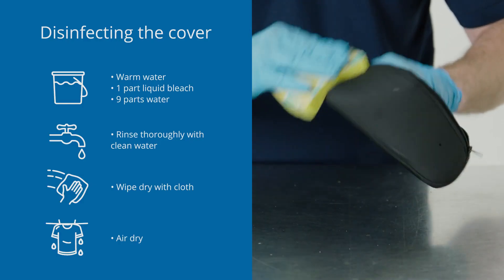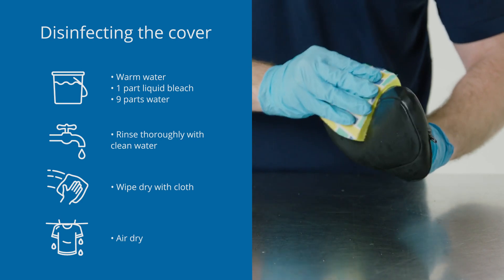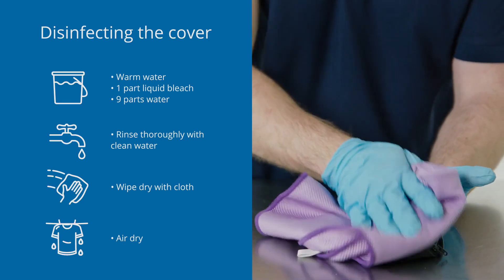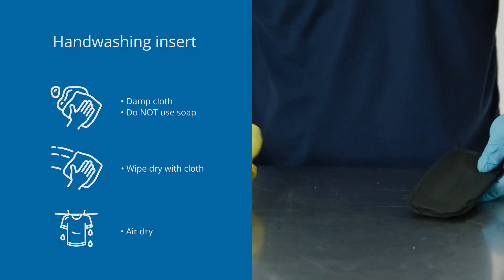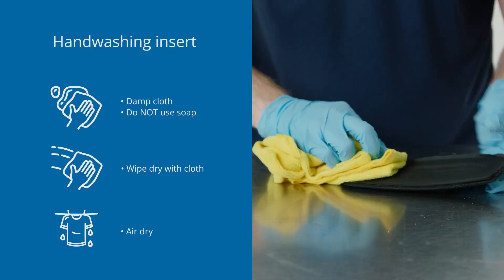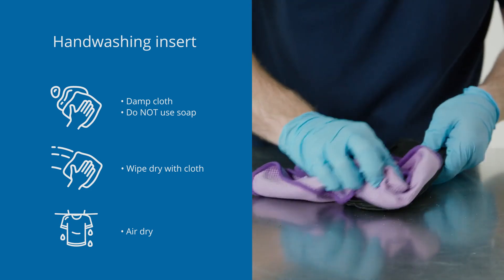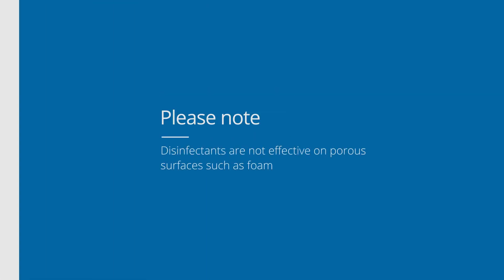To disinfect the cover after cleaning, hand wash in warm water using one part household bleach per nine parts warm water. Rinse thoroughly with clean water and allow to air dry completely before use. For cleaning the inserts, wipe lightly with a damp cloth, making sure not to use soap. Wipe the inserts off with a clean cloth and allow to air dry flat completely. Please note that disinfectants are not effective on porous surfaces such as foam.